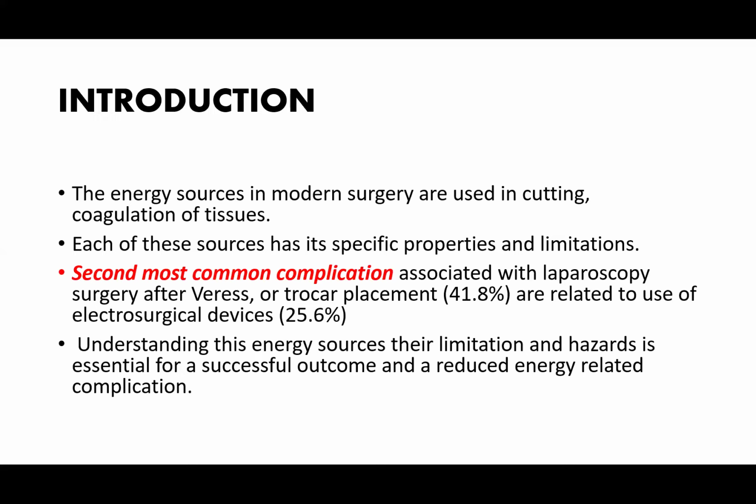various limitations. Now, energy sources account for the second most common complication associated with laparoscopic surgery after trocar placement. You should understand that the commonest cause of complications in laparoscopic surgery is placement of the port during the access.